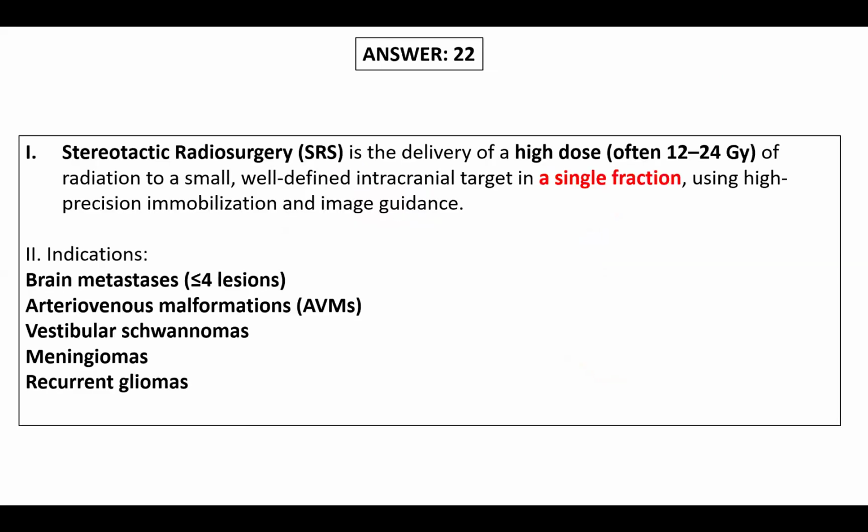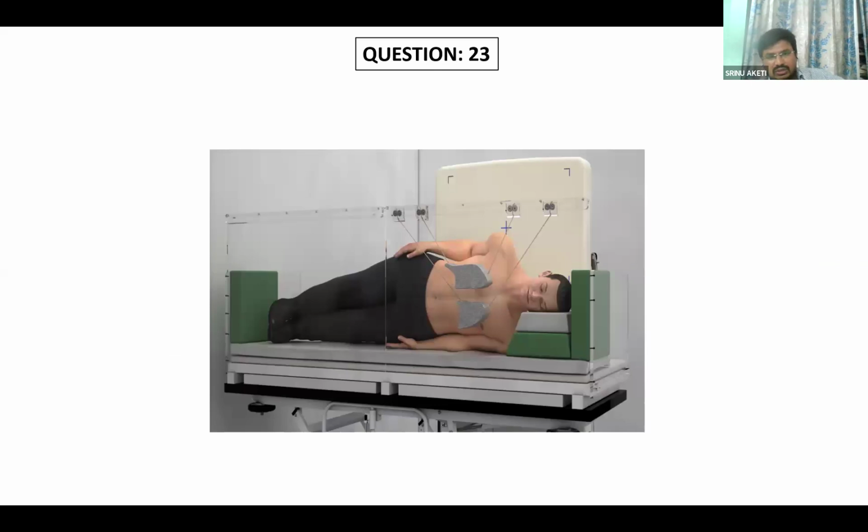Next, last, can you say something about this picture? Yes, sir. It is representing total body irradiation. Mainly we use it in acute lymphoblastic leukemias, AMLs, and some selected cases of lymphomas. Here they have shown the beam spoiler with the lung shielding, and the patient is positioned in the lateral body position, decubitus we call it.